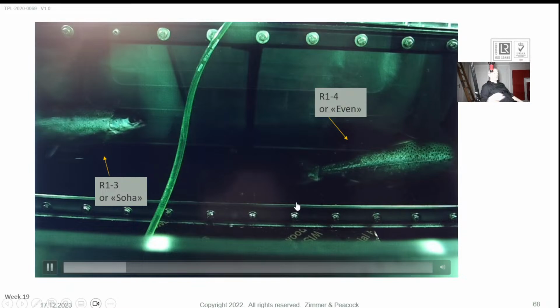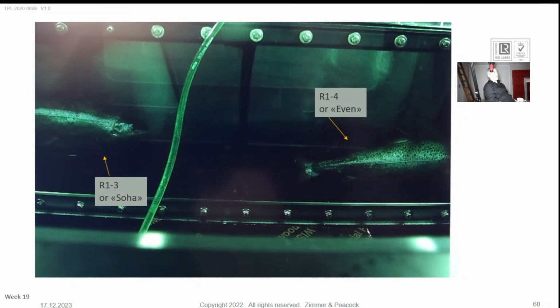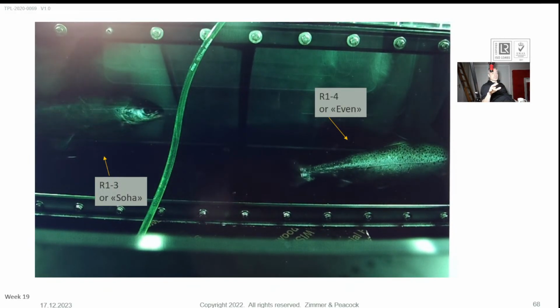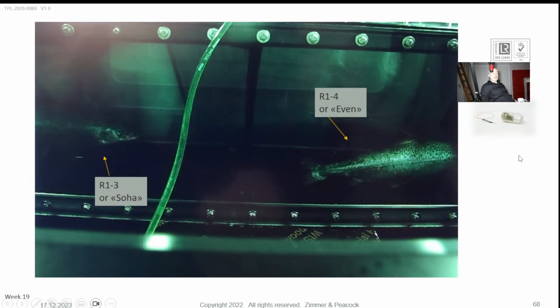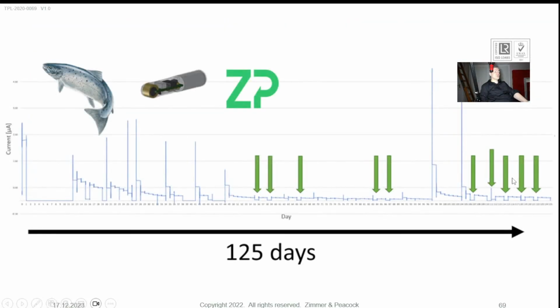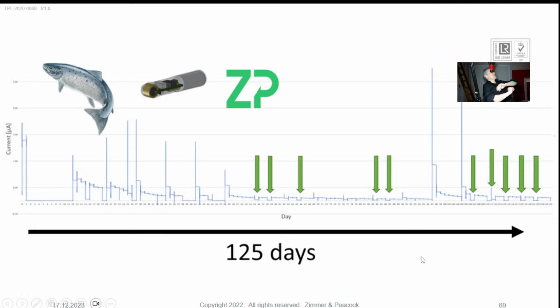And these are fish swimming around with those packages inside them. They're in what's called a RAS system, which is a recirculating aquatic system. They also call it a racetrack. They're pumping the water around, and these fish are swimming around with these packages implanted in them. So we are doing continuous cortisol measurement, but we're doing it in fish. We're doing it because in Norway, the second biggest industry after oil and gas is fish farming, and it's salmon. So we're doing it to measure the stress levels in fish.